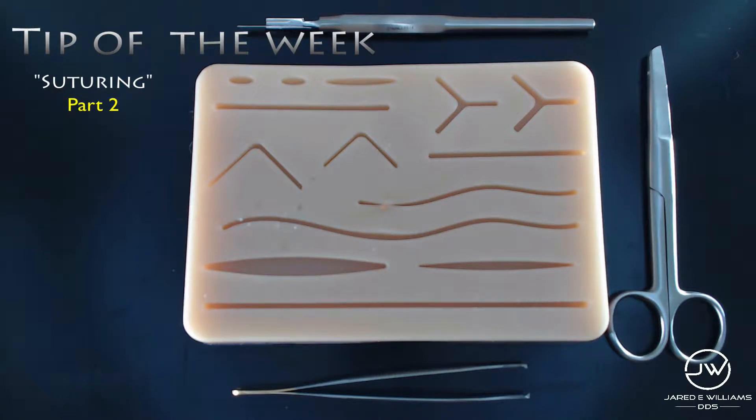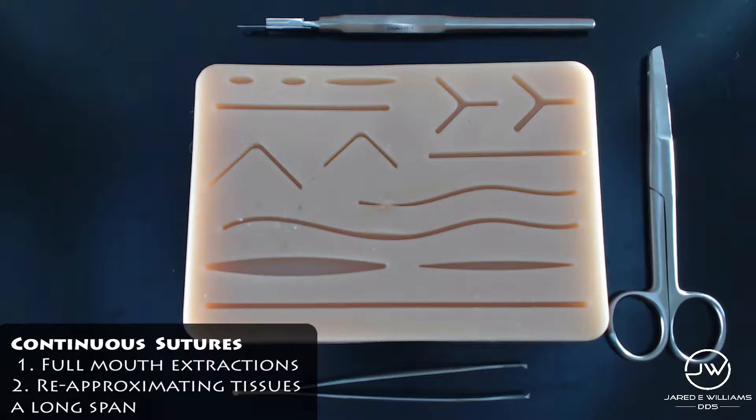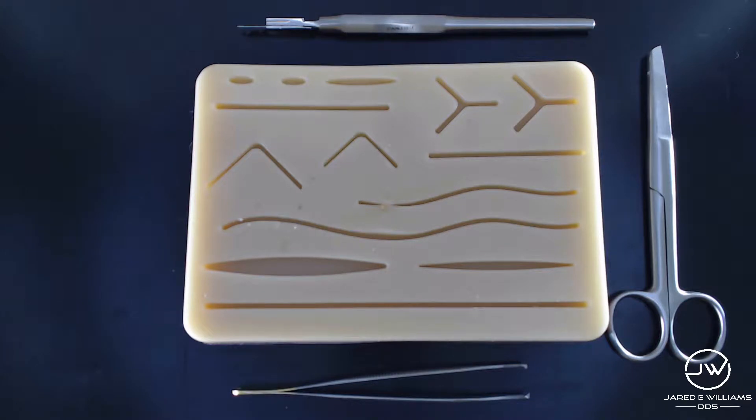Now, this suture is going to be great when you're doing procedures such as a full mouth extraction and you're re-approximating tissues over a long span. Don't be concerned with the continuous suture. I know for some it's eluded, but I want to make this real simple and we're going to use that today.